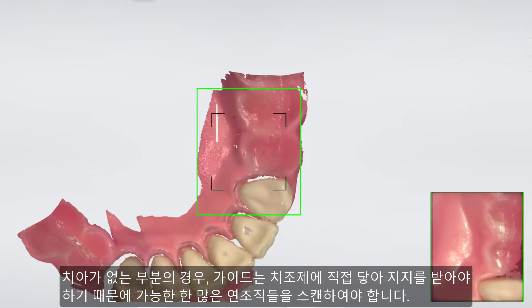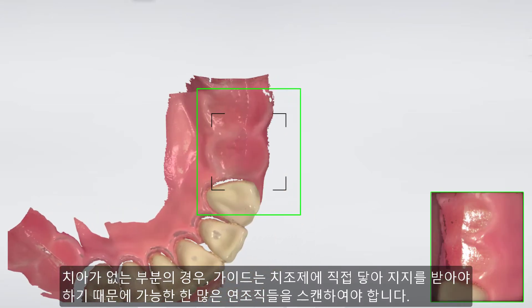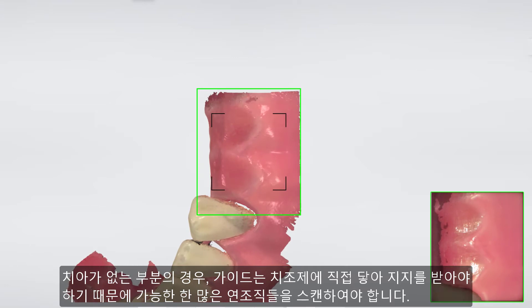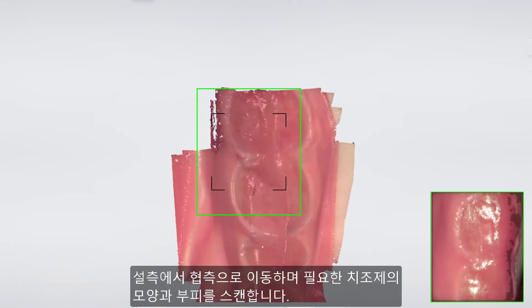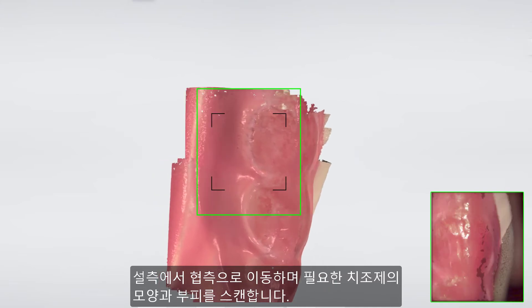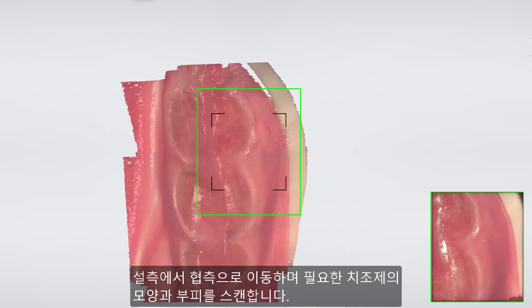For toothless areas, scan as much of the soft tissue as possible, because the guide will later rest directly on the crest and get support from it. Use the shape and the volume of the crest, riding from lingual to buccal, scanning the area we need.